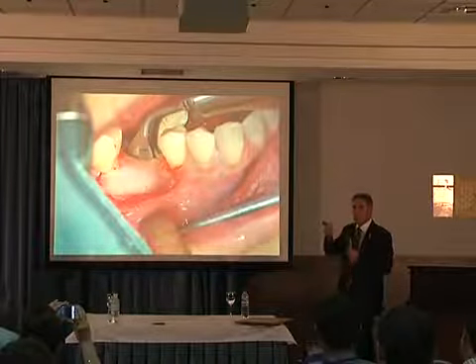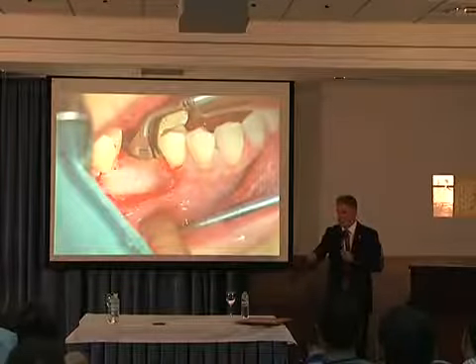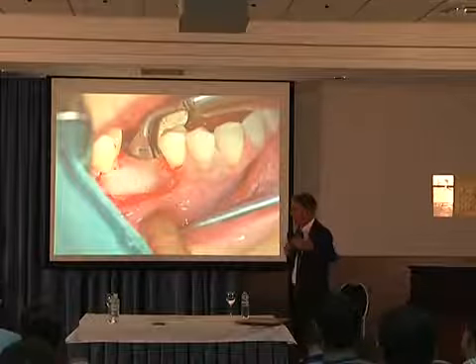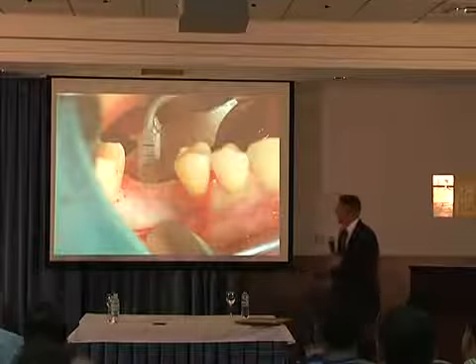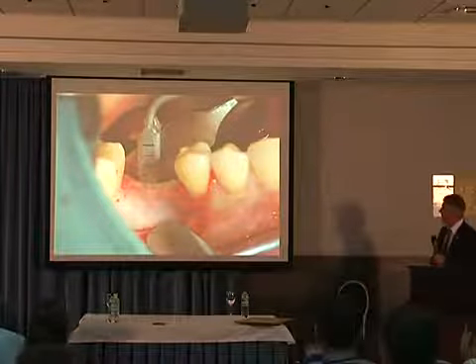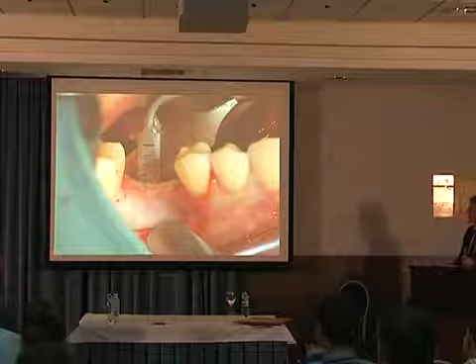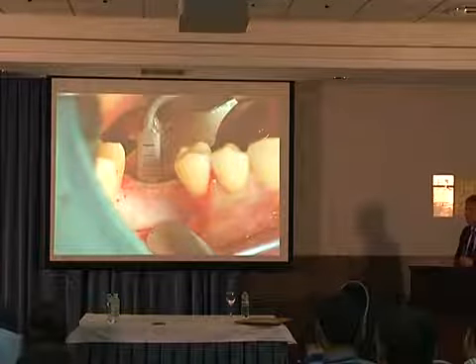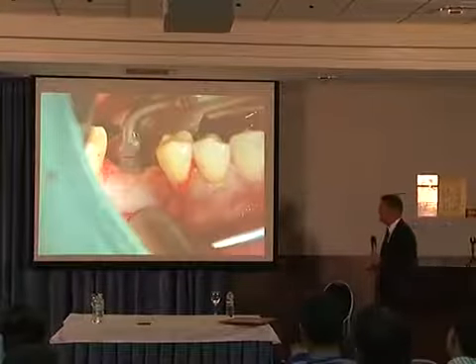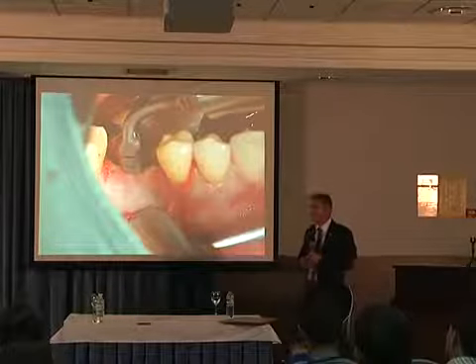So if our implant is 11 millimeter, for example, we go 9 millimeter inside. Only in the last 2 millimeter, we want to have the primary stability for the implant, no pressure on the new buccal plate. Если вы планируете поставить имплантат 11 миллиметров длины, то достаточно вам пройти 9 миллиметров с помощью этого инструмента и хотя бы 2 миллиметра оставить для того, чтобы получить как бы первичную стабилизацию имплантата после расщепления. Next step, the bigger one. Следующий шаг, мы берем чуть больше, по толщине имеется в виду, наконечник, который продолжает расщеплять альвеолярный отросток.